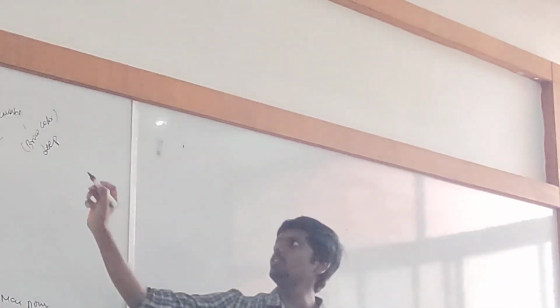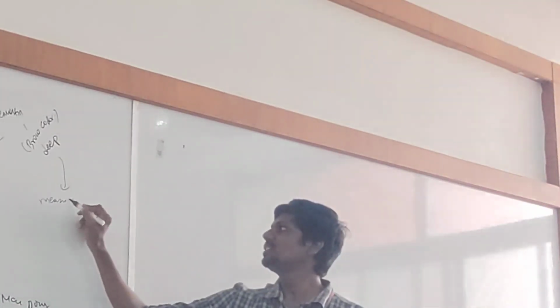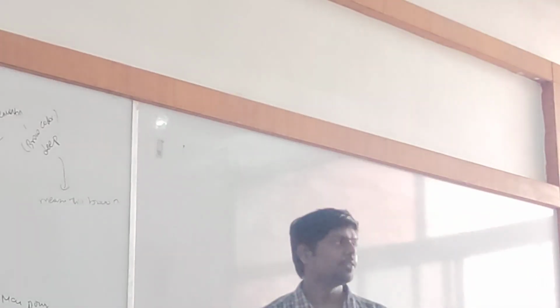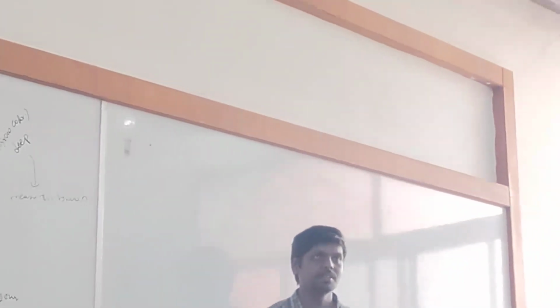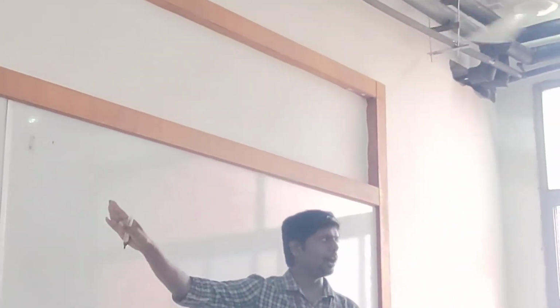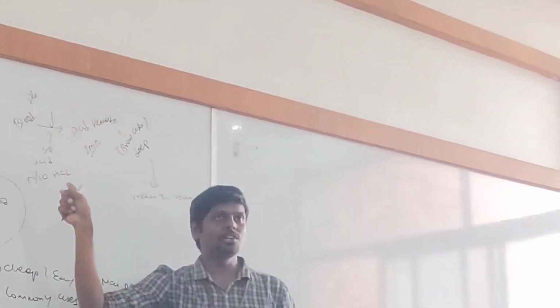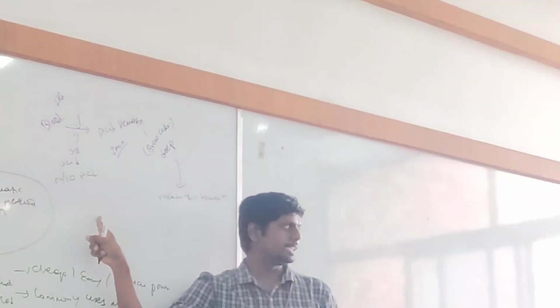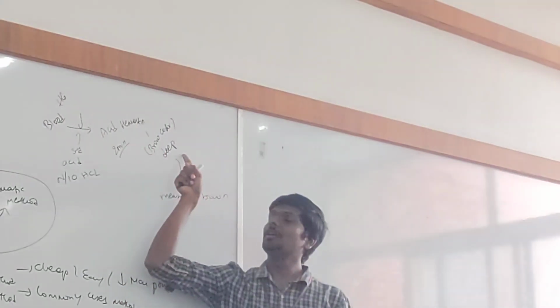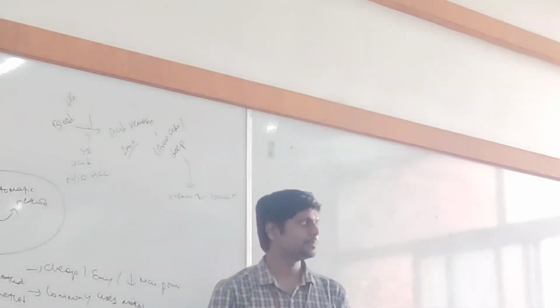Now we are going to measure this brown color. So this is the idea behind the principle of Sahli's method. We are subjecting hemoglobin to an acid called N/10 HCl, leading to a product called acid hematine that is brown in color. Is the principle clear to everyone?